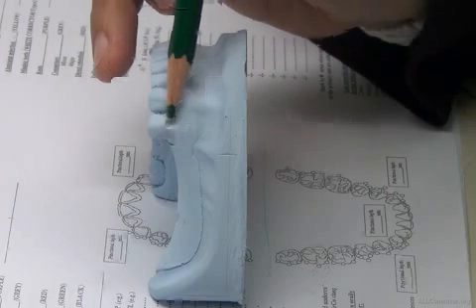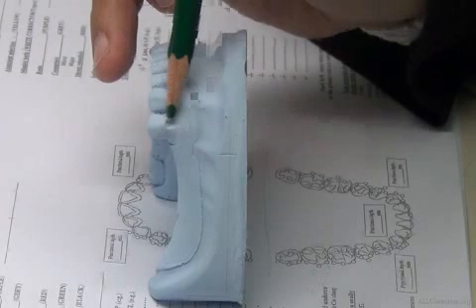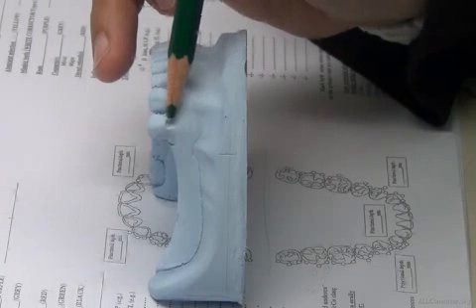Okay, let's try to find a clasp. Say this undercut, for example. Its relation to the survey line occlusally: it's below it, in the suitable, measured undercut. Not any undercut. I have to measure it using the undercut gauge. Its relation to the gingiva: it's above it. How much above it? Depending on the clasp.